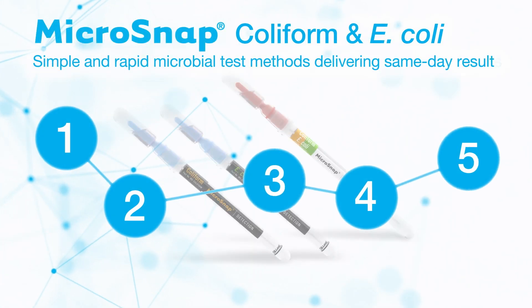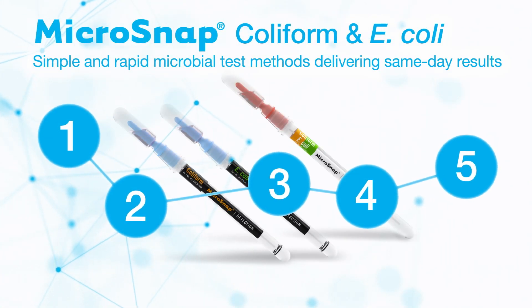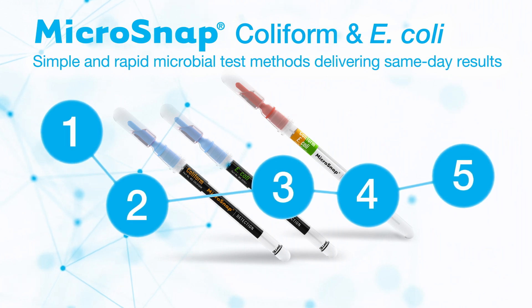Welcome. In this video, we will guide you through the Microsnap coliform and E. coli test methods. Please follow these five simple steps in order to achieve same-day results.